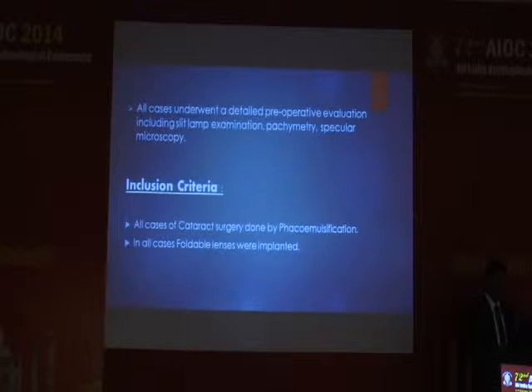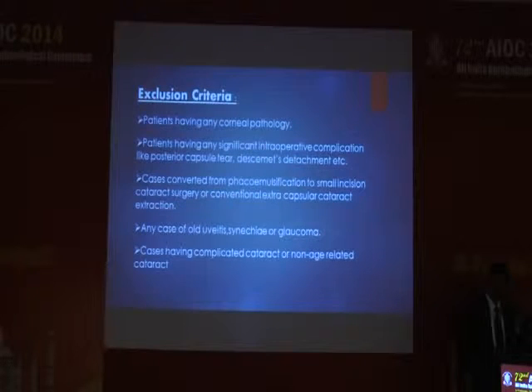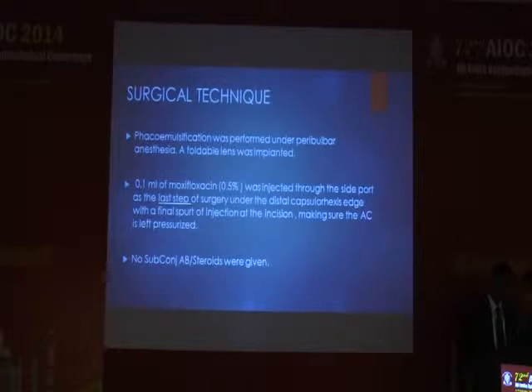All cases underwent a detailed preoperative evaluation including slit lamp examination, pachymetry and specular microscopy. All cases of cataract surgery with phacoemulsification and with foldable IOLs were included in the study, whereas patients with any corneal pathology, with any significant intraoperative complications like PC tear, with any cases of old uveitis, glaucoma or posterior synechiae were excluded from this study.